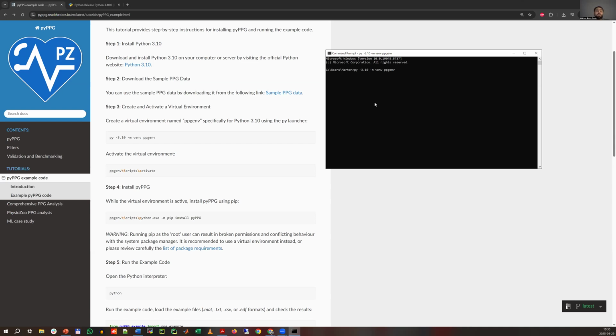You can also create a virtual environment through your IDE, your PyCharm. If you are a little bit more advanced in Python, I can recommend using Miniconda because it makes it much more comfortable to create and handle your environments. So after that, we created this environment.